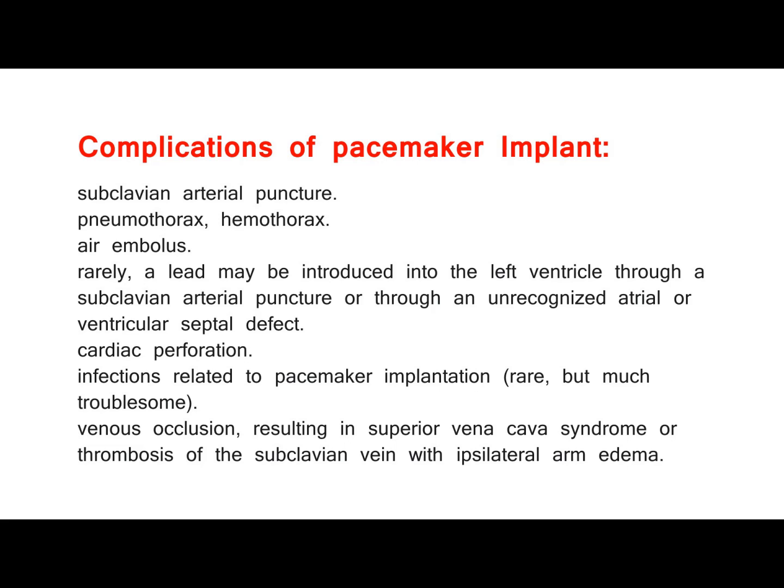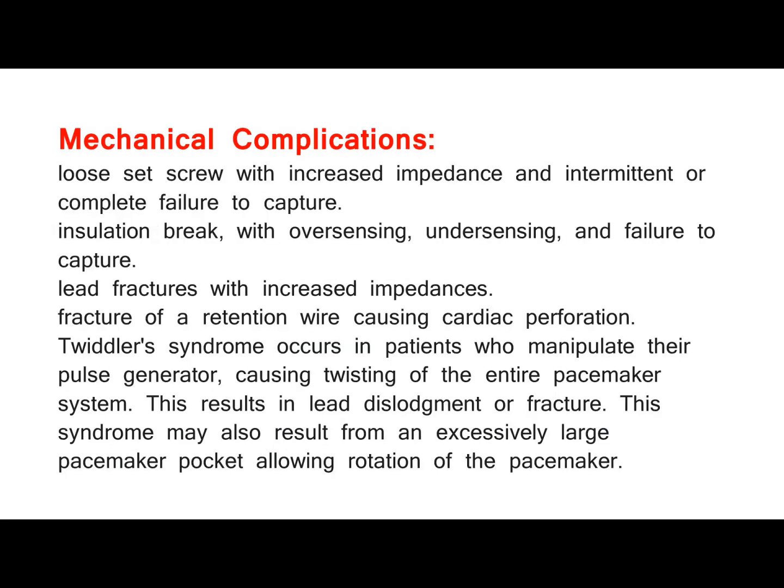Subclavian arterial puncture, pneumothorax, hemothorax, air embolus. Rarely, a lead may be introduced into the left ventricle through a subclavian arterial puncture or through an unrecognized atrial or ventricular septal defect. Cardiac perforation. Infections related to pacemaker implantation, rare, but much troublesome. Venous occlusion, resulting in superior vena cava syndrome or thrombosis of the subclavian vein with ipsilateral arm edema. Mechanical complications.